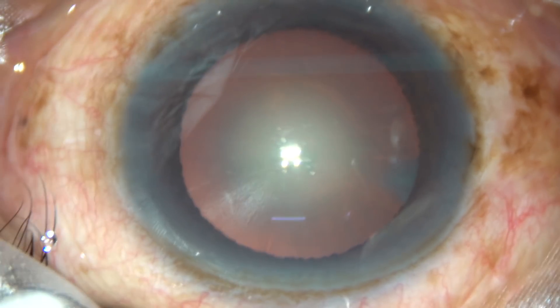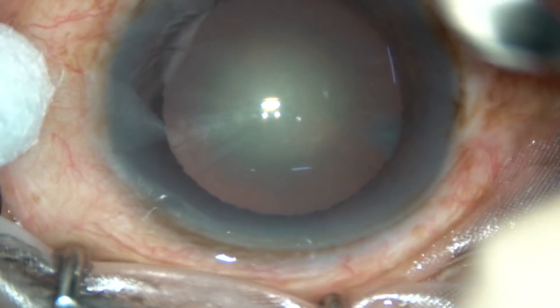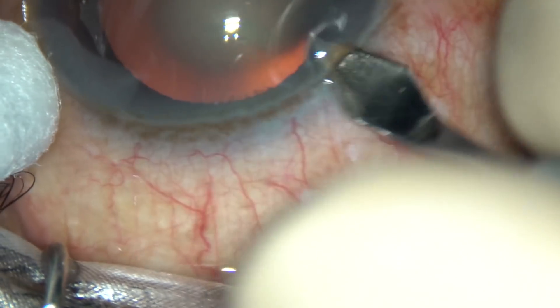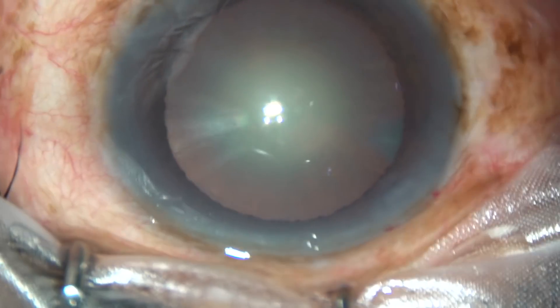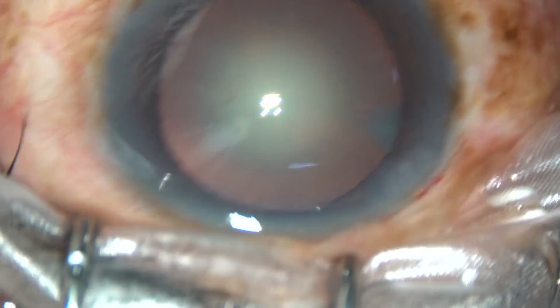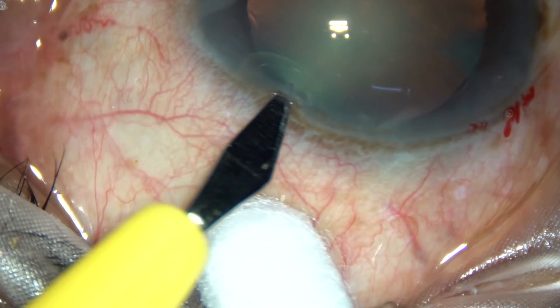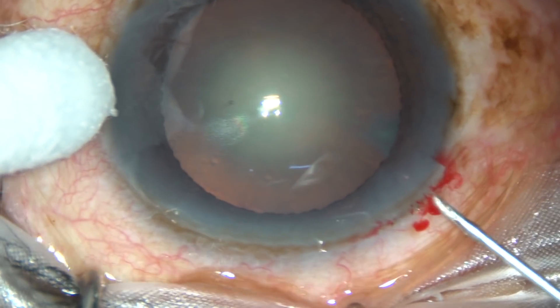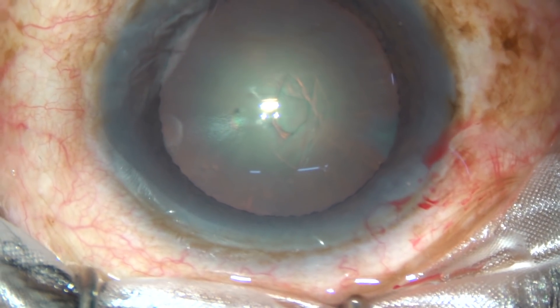Dear colleagues, this is phacoemulsification of a cataract with grade 3 nuclear sclerosis. In this case, hydro-dissection has not been done at all. Let us see how phacoemulsification can be done without hydro-dissection. This video is a tribute to Dr. Naran Bhardhului, from whom I learnt this technique — the technique of no-hydro-phaco. Dr. Naran Bhardhului says this is pure phacoemulsification and he never does hydro-dissection in his phaco surgeries.